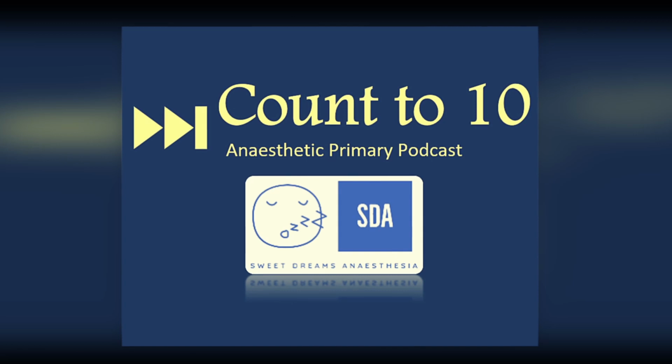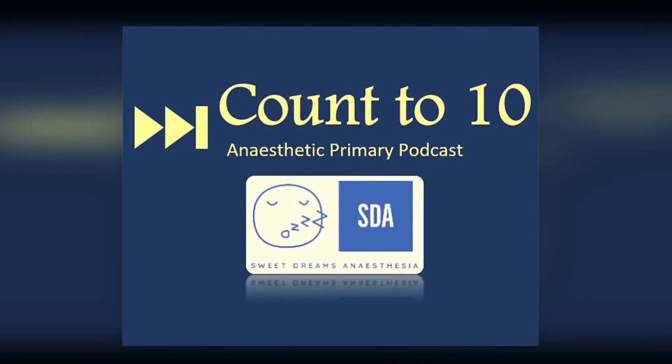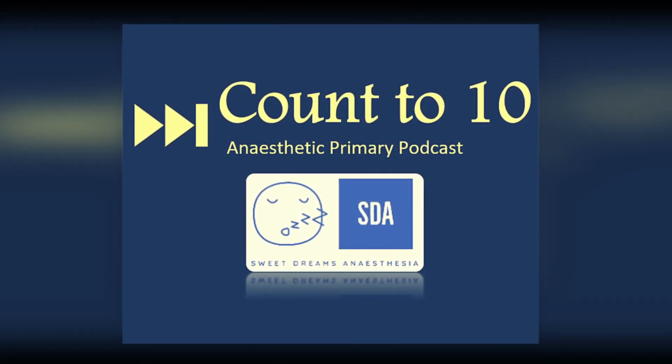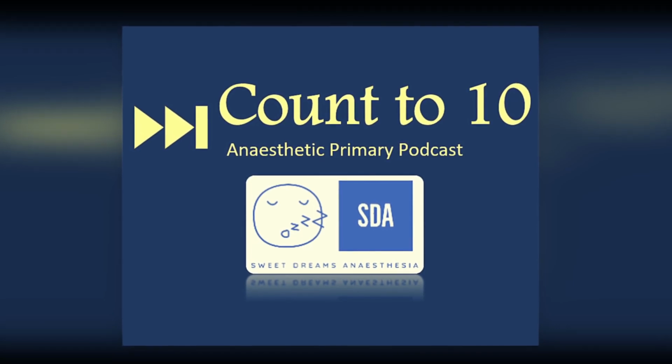Now let's look at some errors that can occur with the pulse oximeter. The simplest way to think about these errors is to break it down into three different phases. You can have errors at the machine, so with the central processor of the oximeter, errors at the probe level itself, so where there's the interface between the probe and the patient, and then patient-related errors.